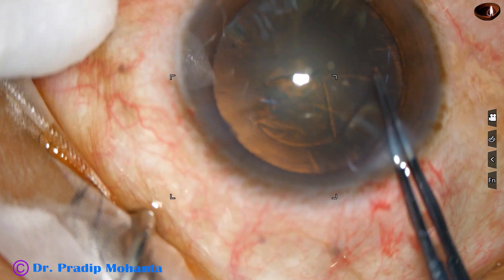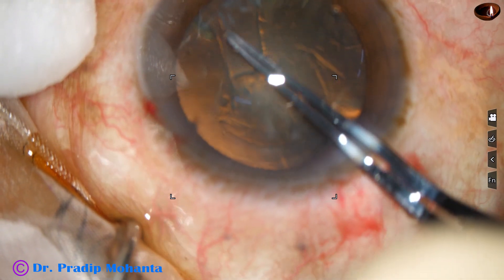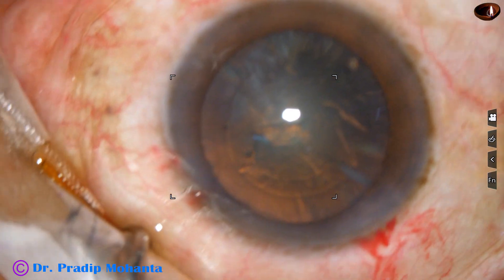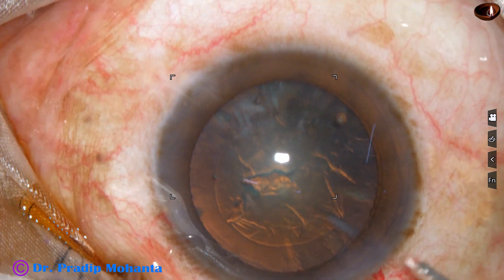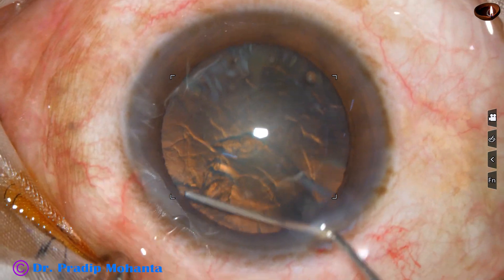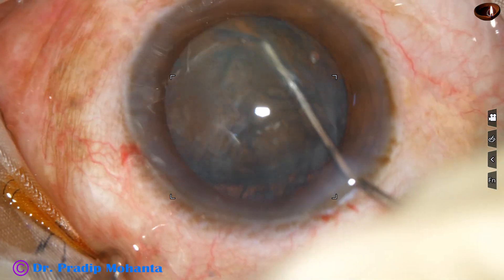In such cases, a pre-chopper is a good help. With the help of a pre-chopper, we can divide the nucleus into several fragments and we can pick up each fragment with the faco needle. In this case, I am going to show the use of the pre-chopper first in real time, then in one third speed of the real time.